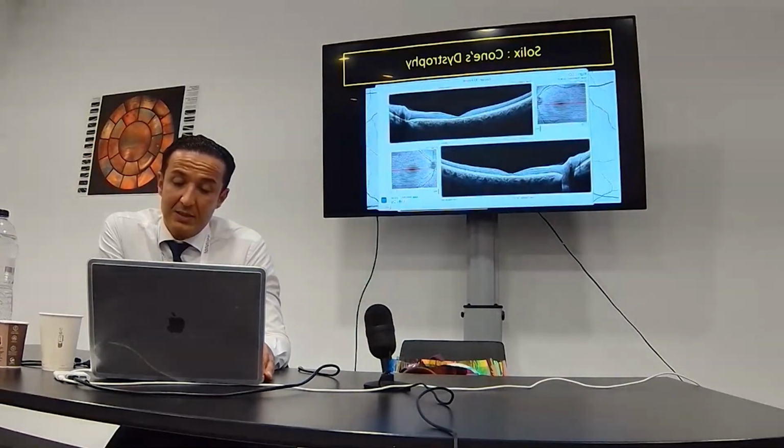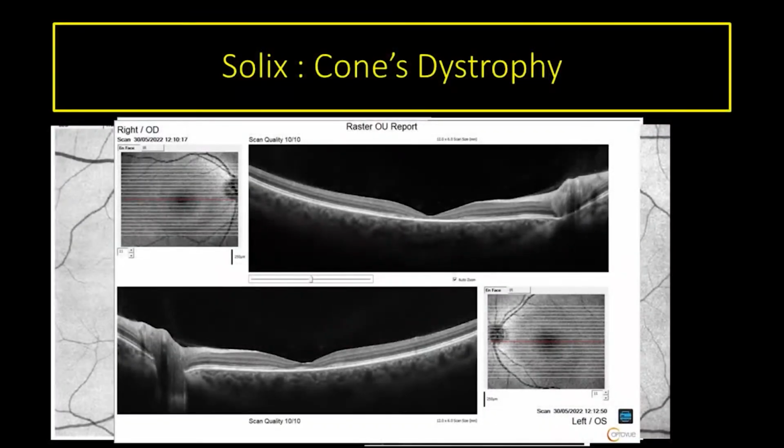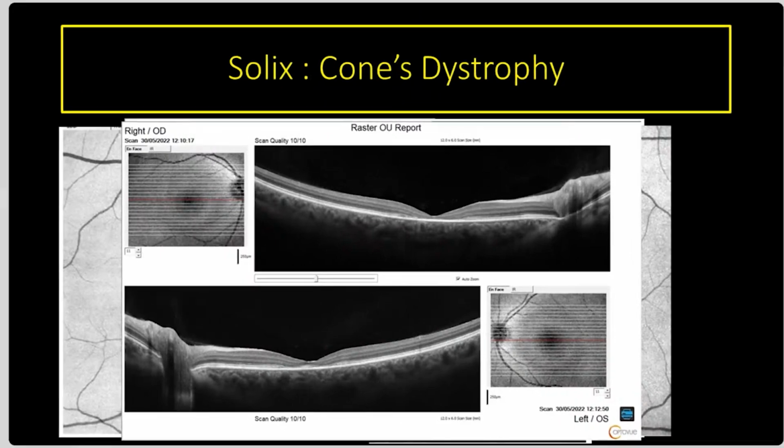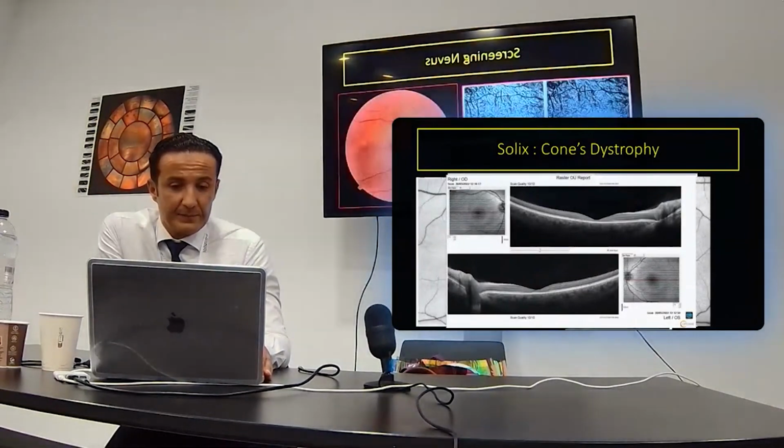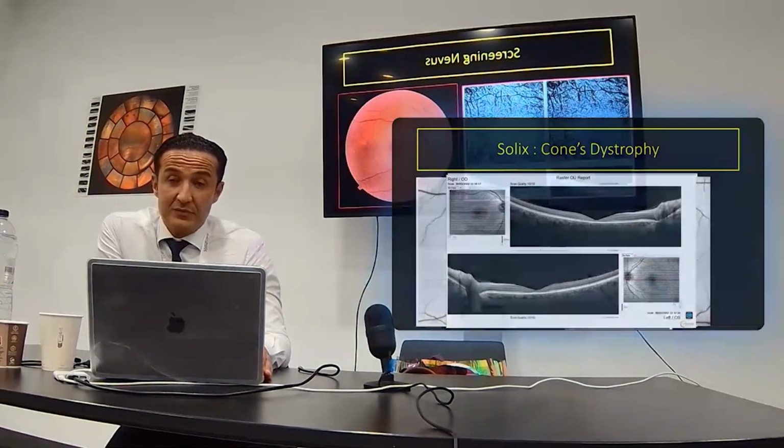And look here, the corresponding B-scan. So you can use more information on the OCT, B-scan, en-face OCT, OCT angiography to give your diagnosis.